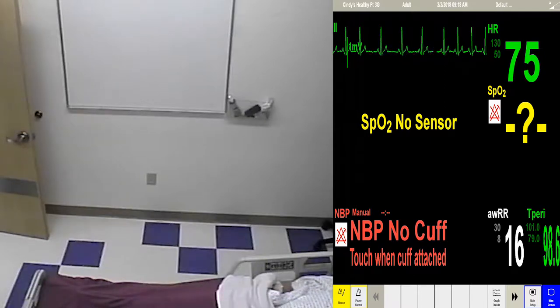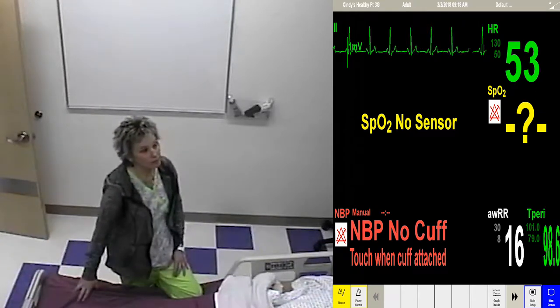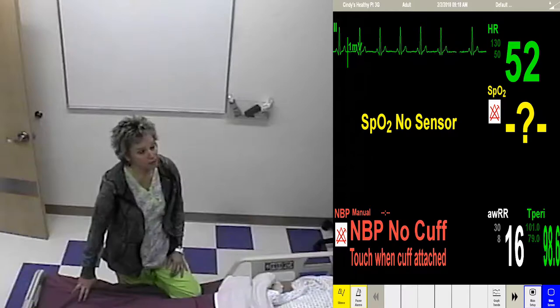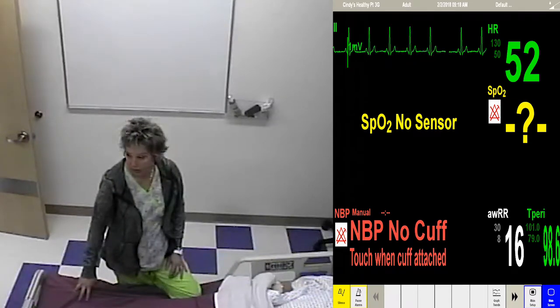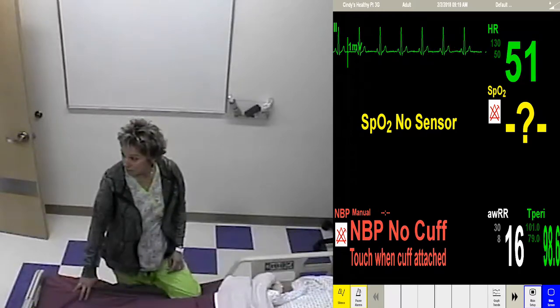Oh, that's slow. Okay. Are there P waves? Yes. Are there QRS waves? Yes. Are there T waves? Yes. Is there a P wave in front of every QRS? Yes. Is there a T wave after every QRS? Yes. Bob your head to the beat. Is it regular? Yes.